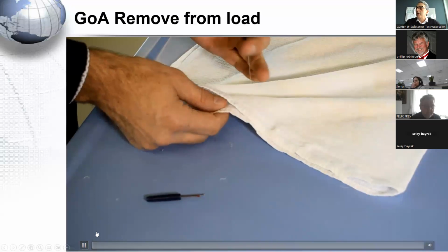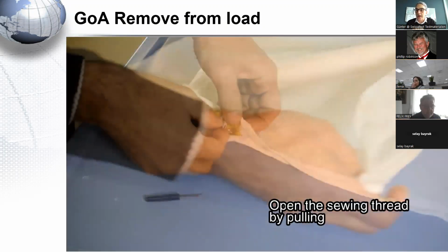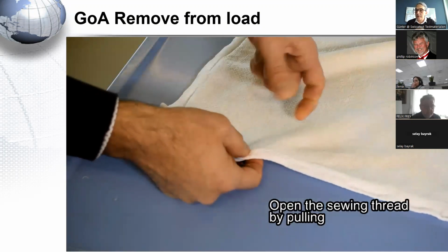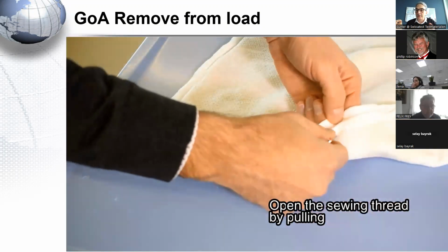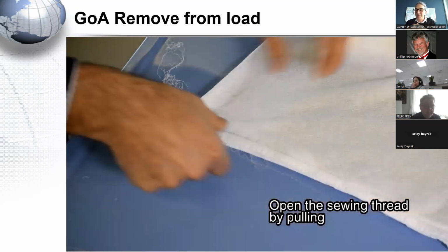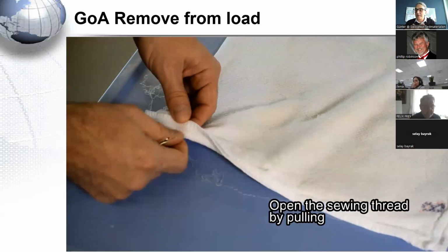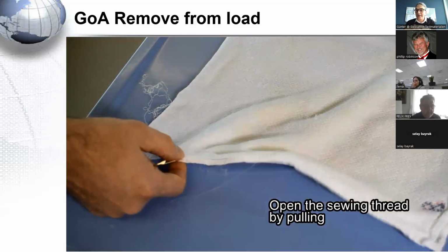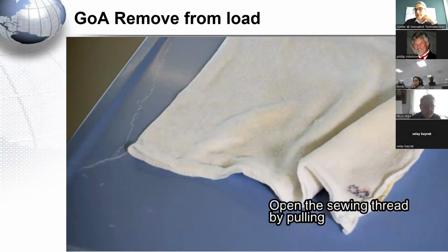Now I've shown in the video different ways how to remove the threads and to bring out the GoA. Here is first by pulling the thread. When you start at the right place, you can easily pull the thread, and the seam is open very easily. This is surely the best way to open the GoA, the towel, but it is not always the case that you find it, and so you can do it also in other ways.